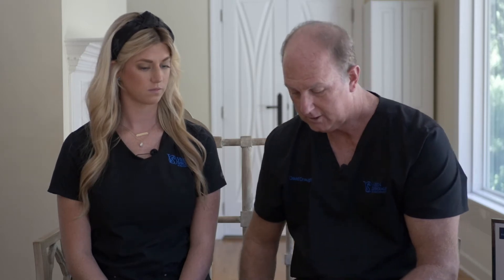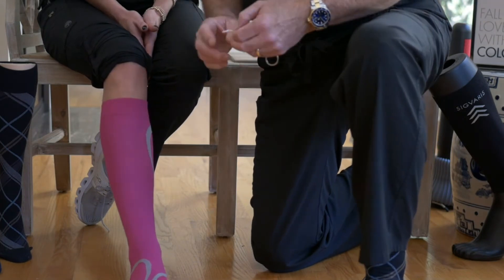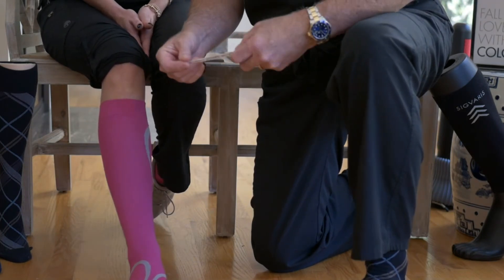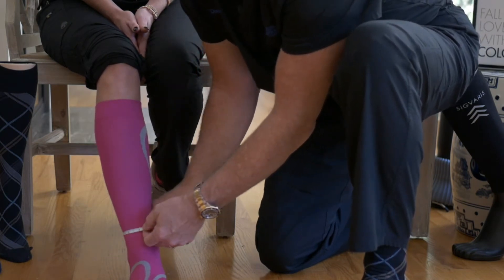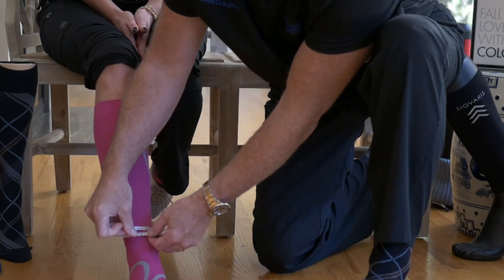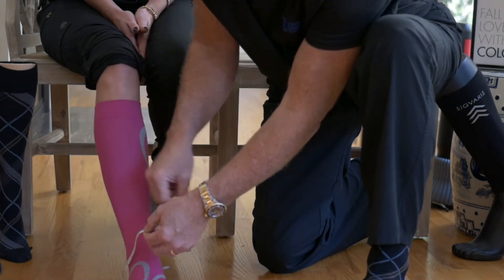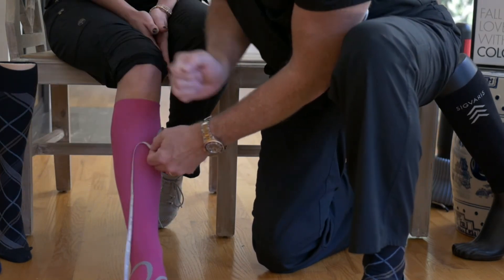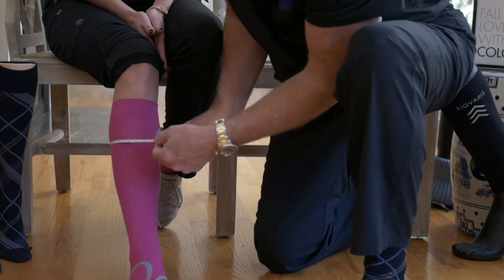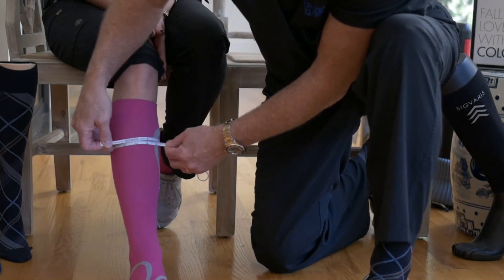The two measurements that mean the most are the calf and the ankle. Most garments measure sizes in inches, but some brands want you to measure in centimeters. Our brand, Sigvaris, goes by inches. You take the smallest area of the ankle and get the number — for Kendall, it's eight and a half. Then you go up to the calf and find the biggest area of the calf, and Kendall's is 14.